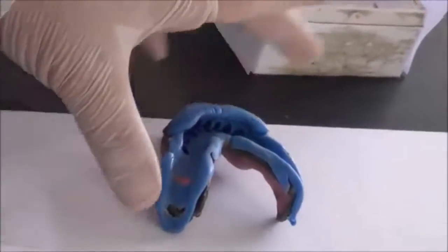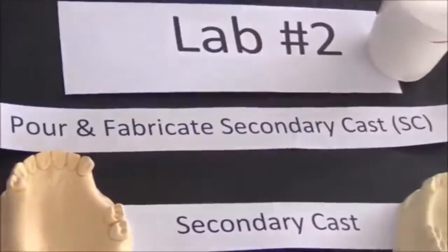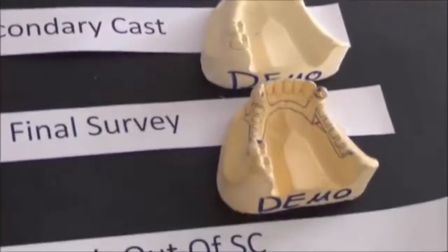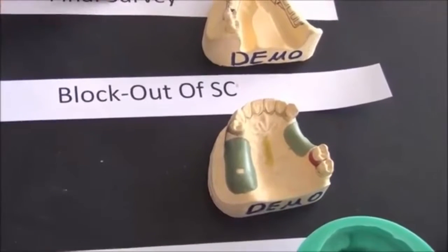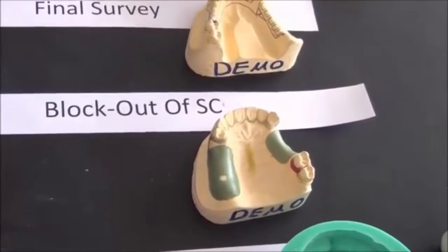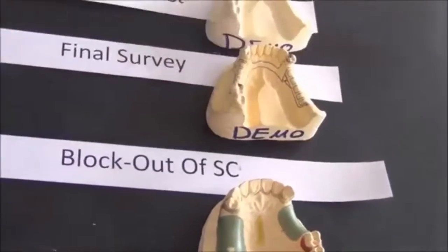This secondary impression is poured using stone. The technician will then have the secondary cast ready. He is going to draw the final survey exactly as present in the authorization form. So the technician will do a blockout of the secondary cast. The blockout procedure will be described in further detail later, but the idea is to prepare the cast in a way that would follow the principles of metal framework design.